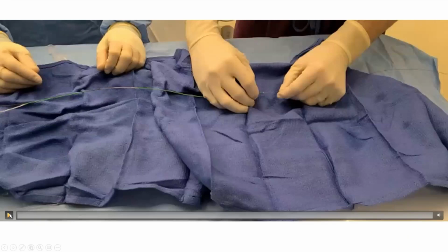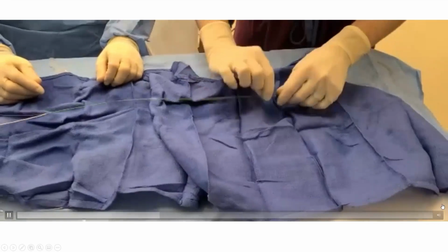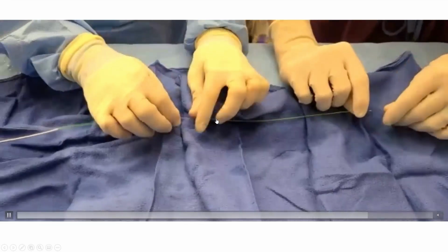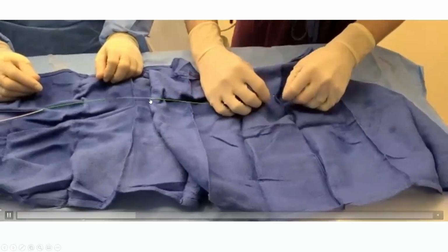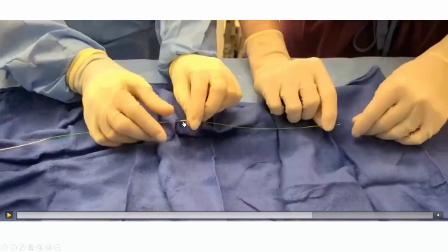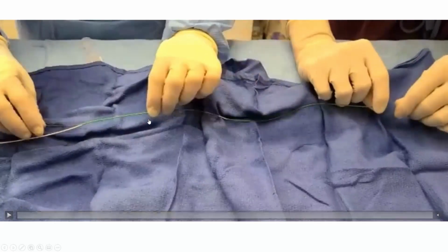And after you collapse that spider basket, this is how we advance it over the BMW wire. Here it's being advanced over the BMW wire, and it will come out just in front of that white port. Again, look, it's advanced, and it will come out here, the BMW wire. This is the monorail portion of the BMW wire. And notice we have to bend it a little bit to allow the BMW wire to come out just in front of that white marker area. Then we hold it.